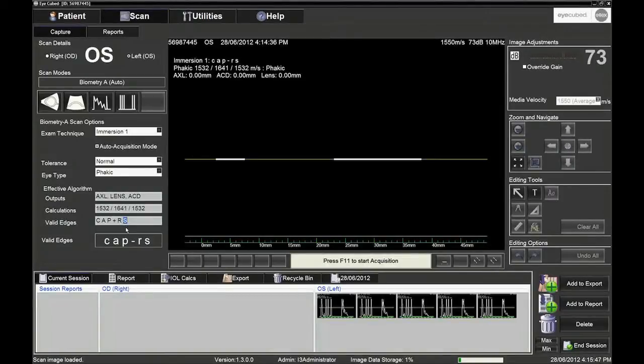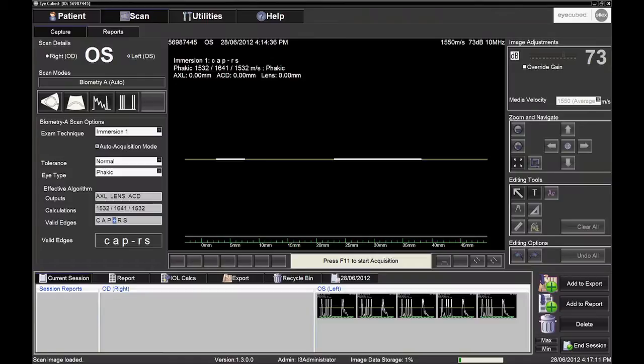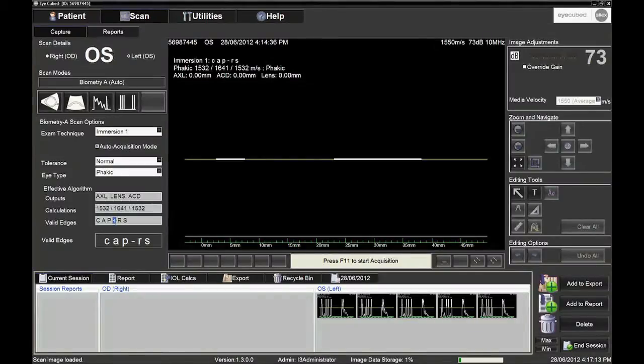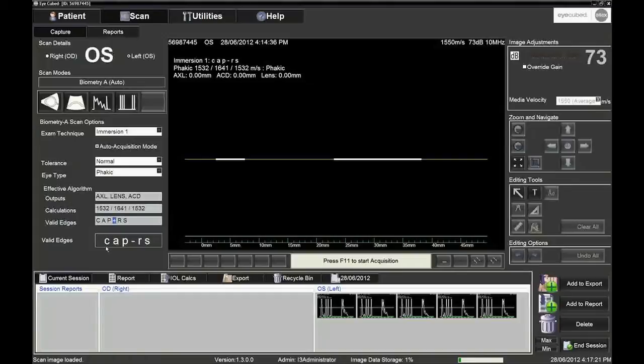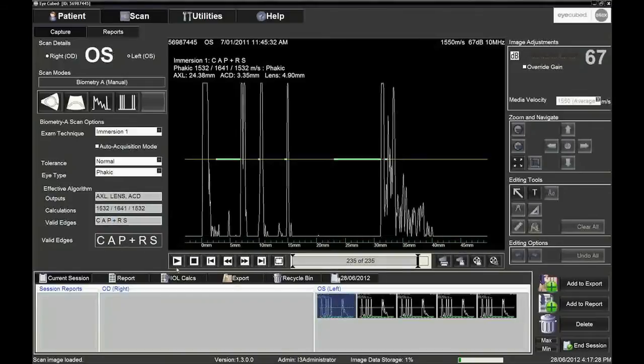The plus sign will be present between the P and R showing that the retinal echo is sharply rising and that the sound beam is perpendicular to the retinal surface. The operator should observe these letters. If any of them appear in lower case, the corresponding echo spike does not fill the recognition criteria of the system.